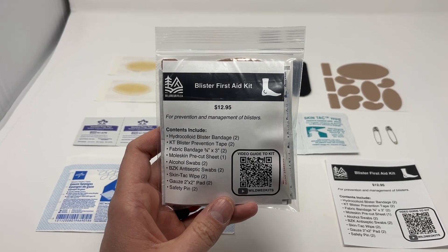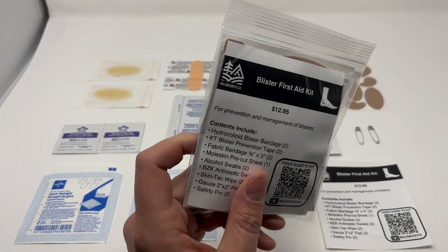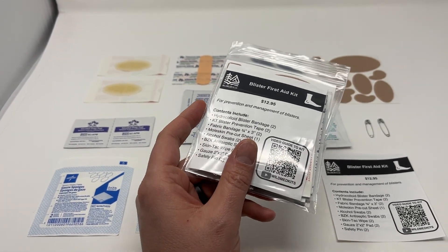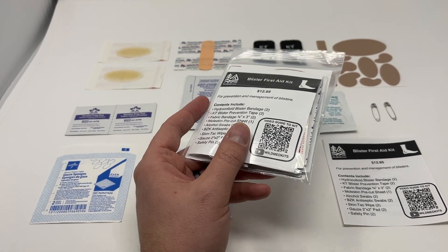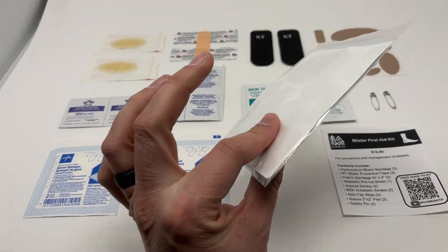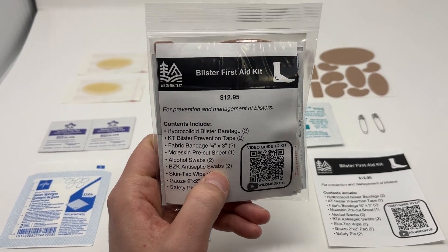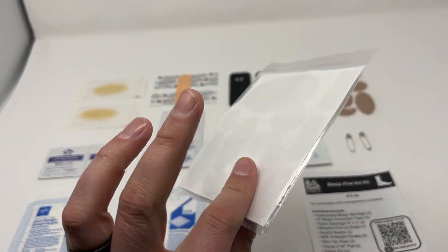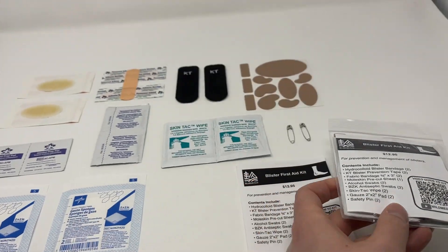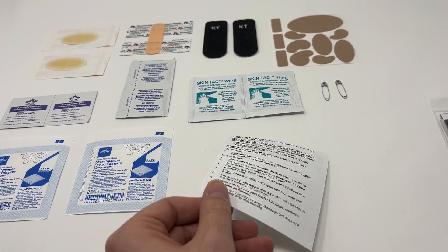This is our brand new blister first aid kit. It's a nice thin module to add to any sort of wilderness, backcountry camping, or home first aid kit. This has everything you could ever need to manage blisters, and it's probably the most comprehensive blister kit on the market — and we kept the price really good for you. It comes in this nice thin water-resistant packaging that keeps everything together, and you're going to get all of these supplies, including an instruction guide.